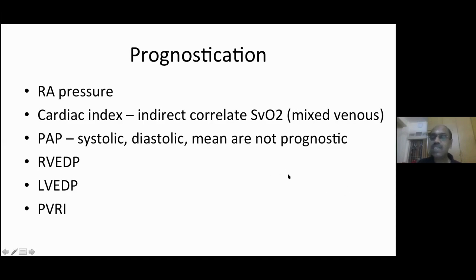If a patient has severe pulmonary arterial hypertension and right heart failure, is post-diuretic stabilized and taken for right heart catheterization, and the PA mean pressure is only 28 millimeters of mercury, should we still do vasoreactivity? Basically, the criteria given for finding a vasoreactivity is a 10 millimeters of mercury fall in the PA pressures and an absolute PA mean pressure coming to less than 40.